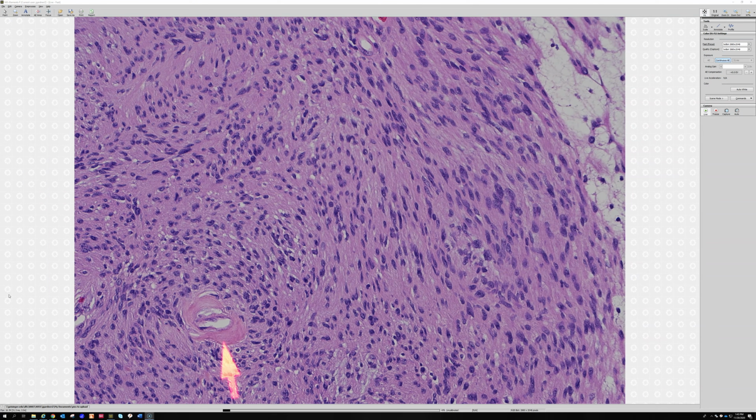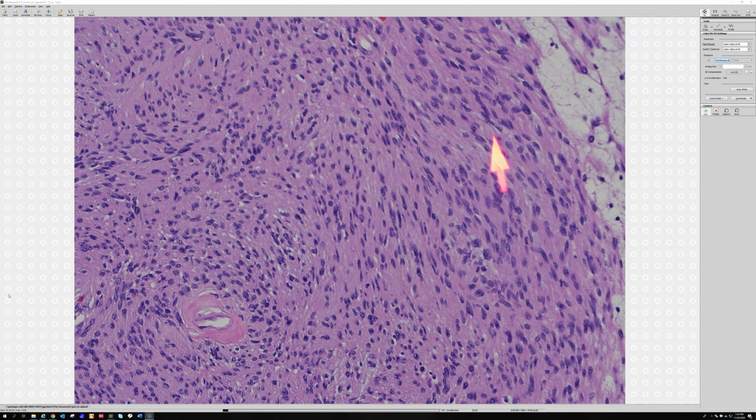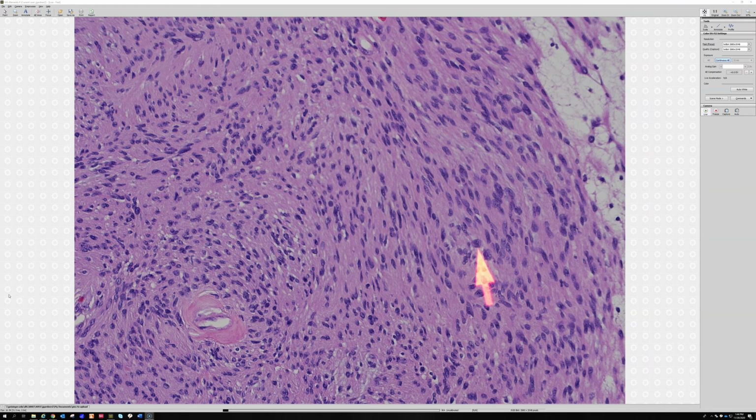So the hyalinization of vessel walls, because see, if you just had this picture here, these spindle cells don't look particularly specific. To me, they look kind of neural, but I think a lot of people might look at that and wonder what it is. There's vague palisading in here, a little bit of lining up of nuclei, but you may be wondering if I'm making that up, right? And I bet a lot of people at home are like, yeah, right. But the palisading here is very, very subtle. It's certainly not a nice textbook Verocay body.